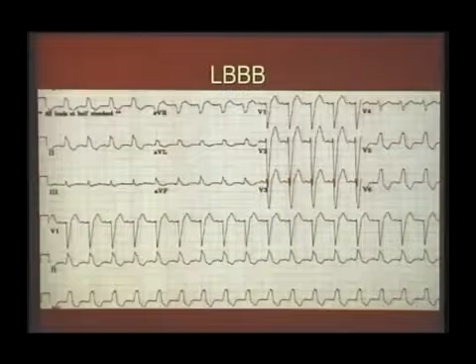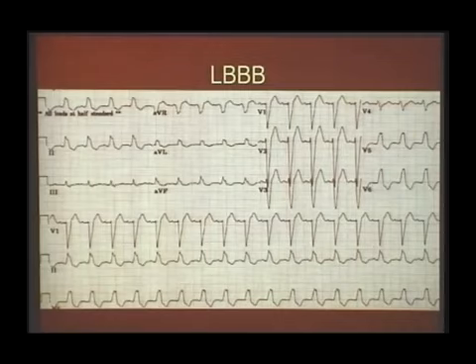Now the first thing to diagnose is what? QRS widening. So see that initial portion there. Initial portion is so sharp there. So the widening is due to the terminal delay. So it is a bundle branch block.